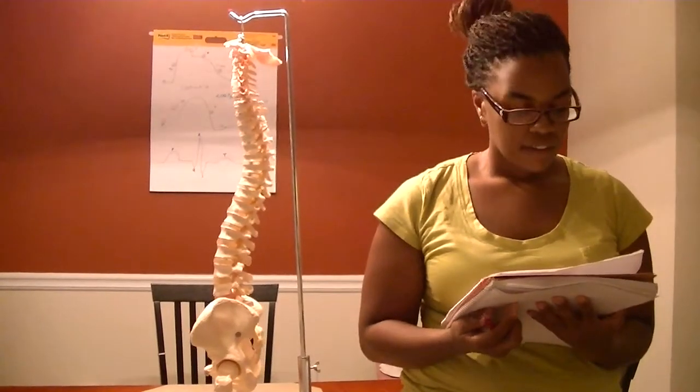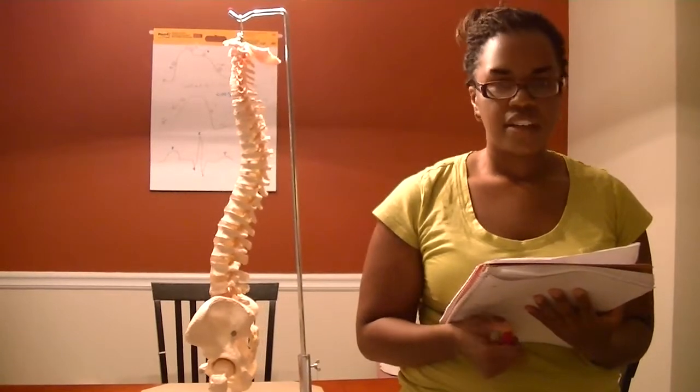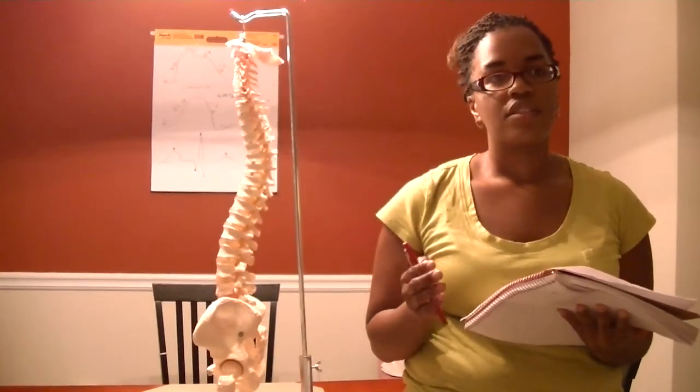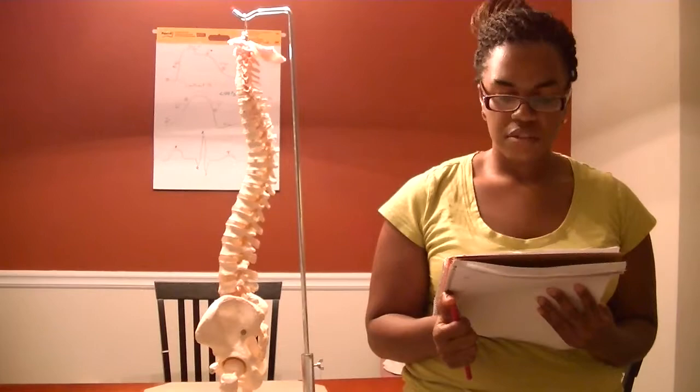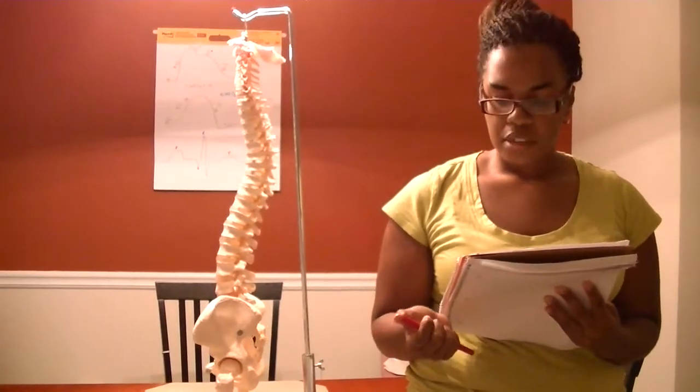For ADI, our adults should have an ADI of between 1 and 3 millimeters. In other words, it should be no greater than 3 millimeters. So this is something that she said in lab that might trip people up on boards sometimes. For children, our ADI should be between 1 and 5 millimeters, or no greater than 5 millimeters.